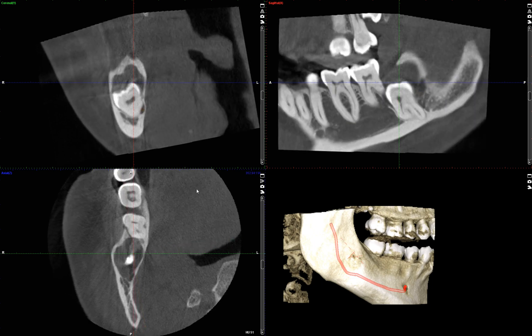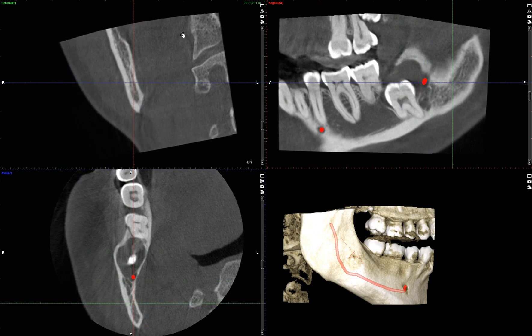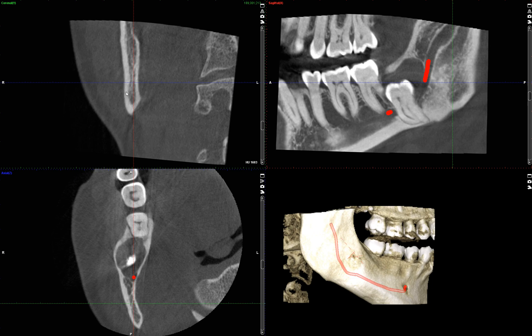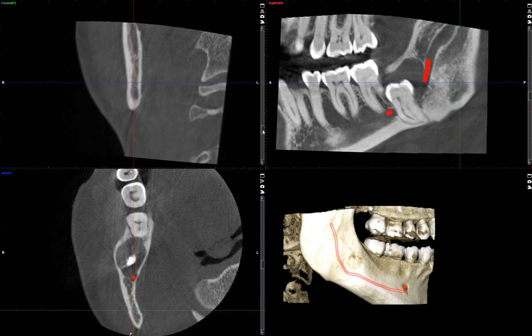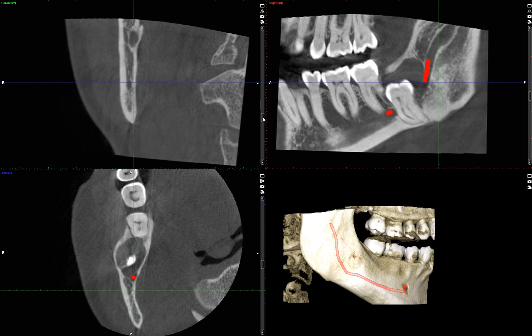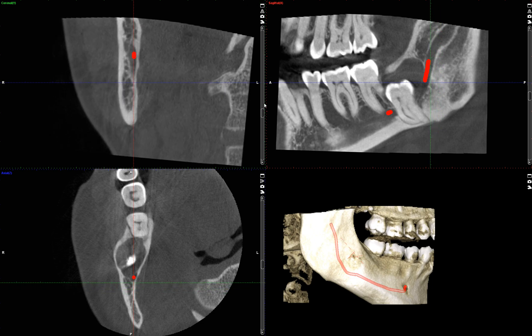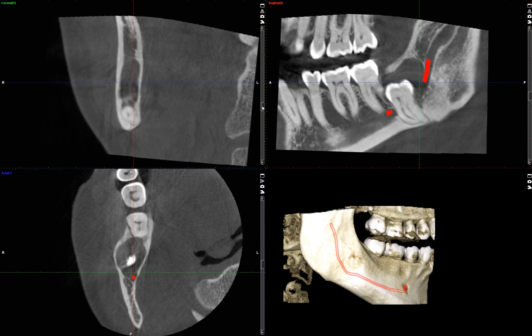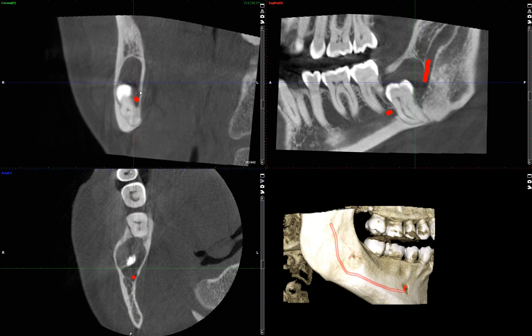Let's go all the way to the back of the mandible and trace the mandibular canal in the coronal plane. Here's the beginning of the mandibular canal at the mandibular foramen. It's coming down nicely — there's that canal, coming down and now abutting next to the lesion. The canal is coursing lingually and inferiorly to the lesion, and also medial to the impacted third molar.